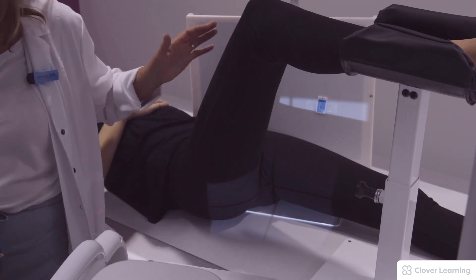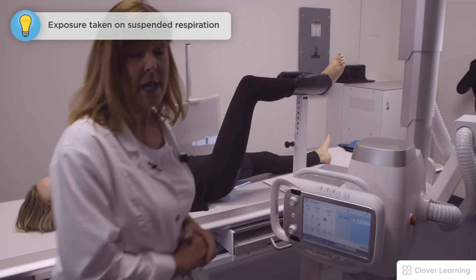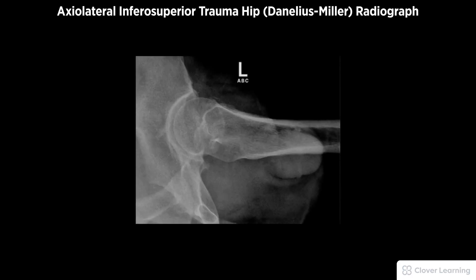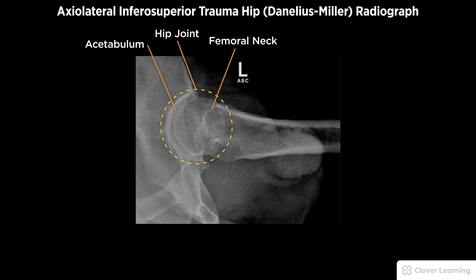A left marker indicates the left leg, the patient holds very still and holds her breath, and the exposure is made. A diagnostic axial lateral inferior-superior trauma hip Daniel-Smiller view radiograph must be free of motion. Demonstrated anatomy should include the hip joint with the acetabulum and femoral neck, free of superimposition of the greater trochanter, with proper visualization of soft tissue and bony detail.